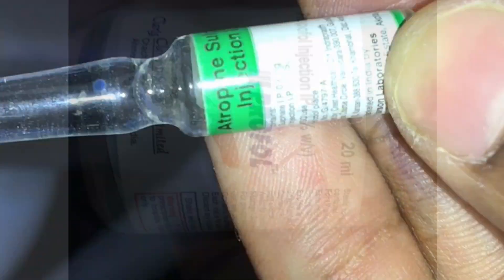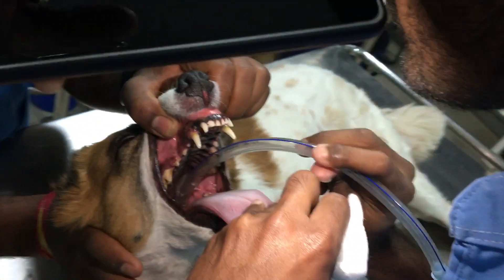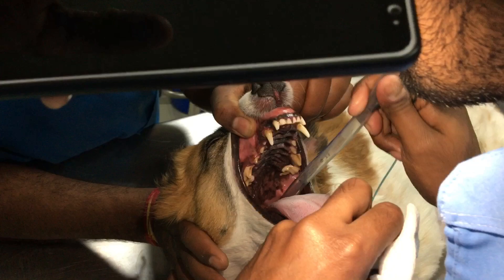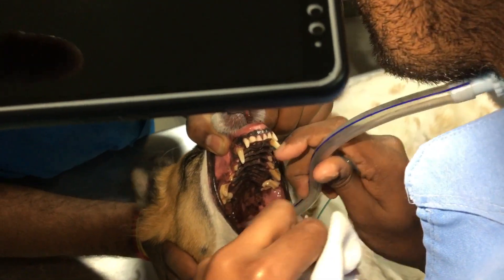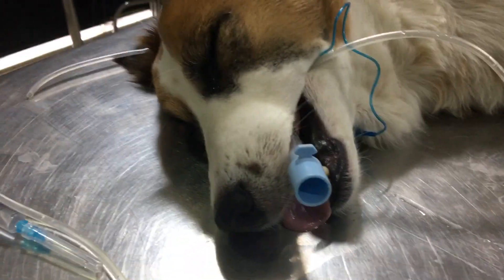For sedation we used acepromazine and atropine; for induction and maintenance we used propofol. After inducing anesthesia we placed an endotracheal tube, which will help us intervene in any anesthetic complications. It was then time to monitor anesthesia.